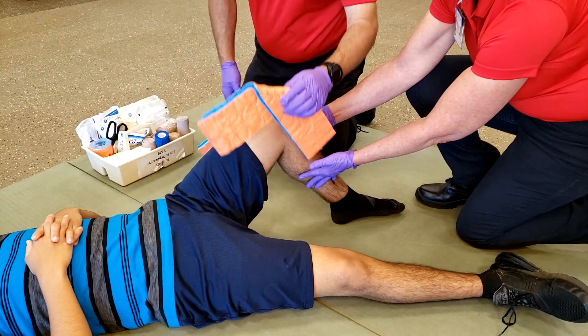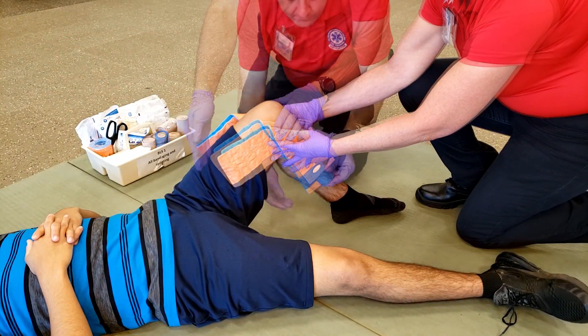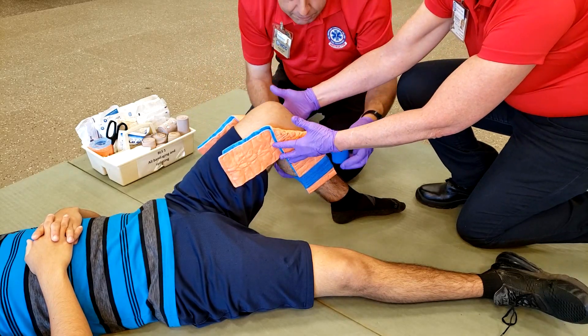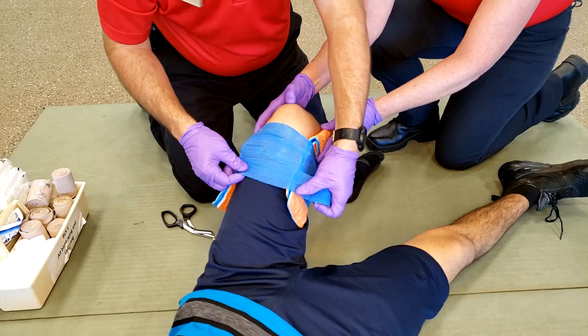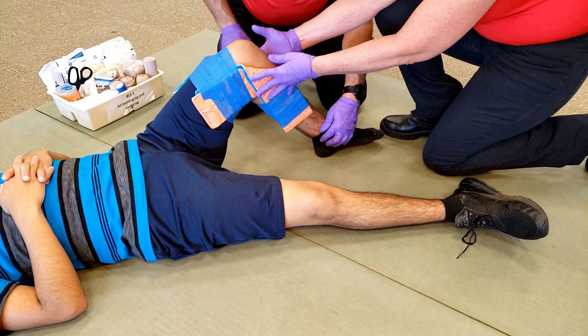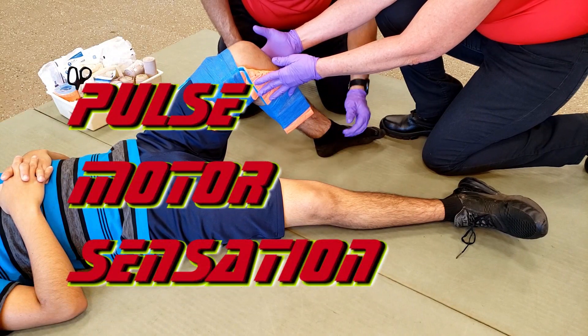Once the Sam Splints are folded, place them on the lateral and medial side of the knee. Secure the splint on the distal side first, and then the proximal side. Once this is completed, check for pulse, motor, and sensation once again.